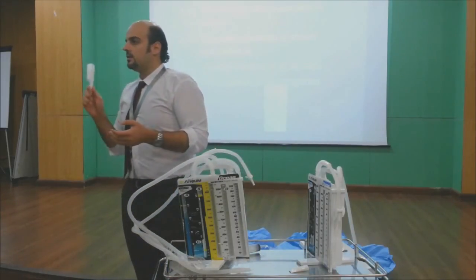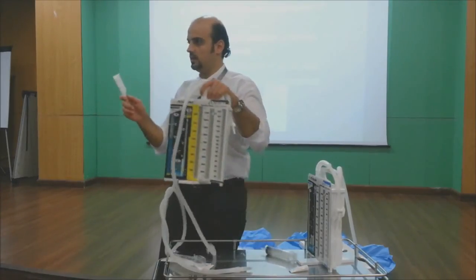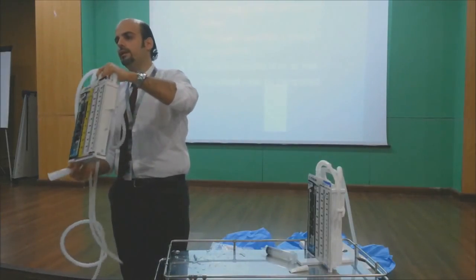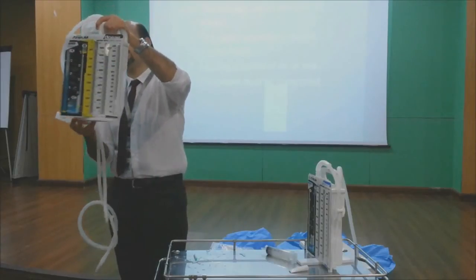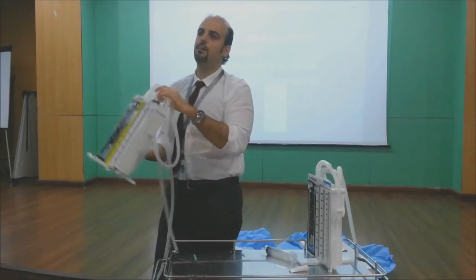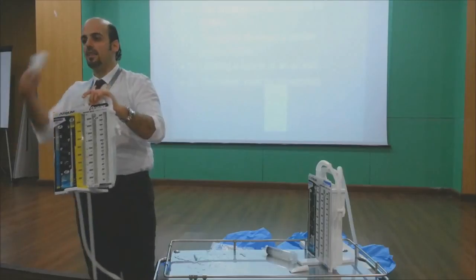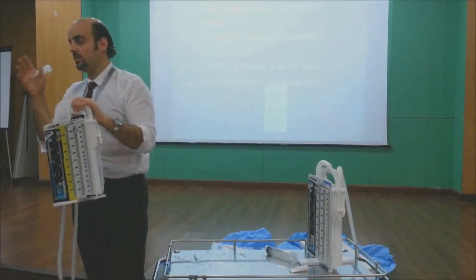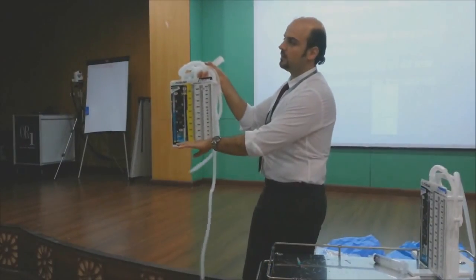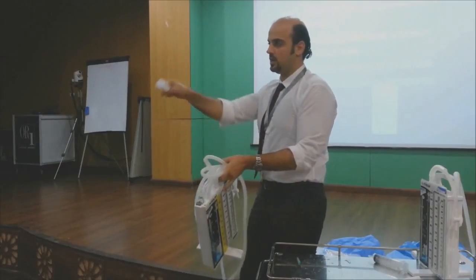Guys, again, you are not allowed to keep the chest tube on the ground like this. It's always like this. Why? If this chest tube is spilled like this, what will happen? The water is down and the air will go inside. So this is serious. The best way to put a chest tube, or if you are in ICU, hang it. You know how to hang it on the bed.